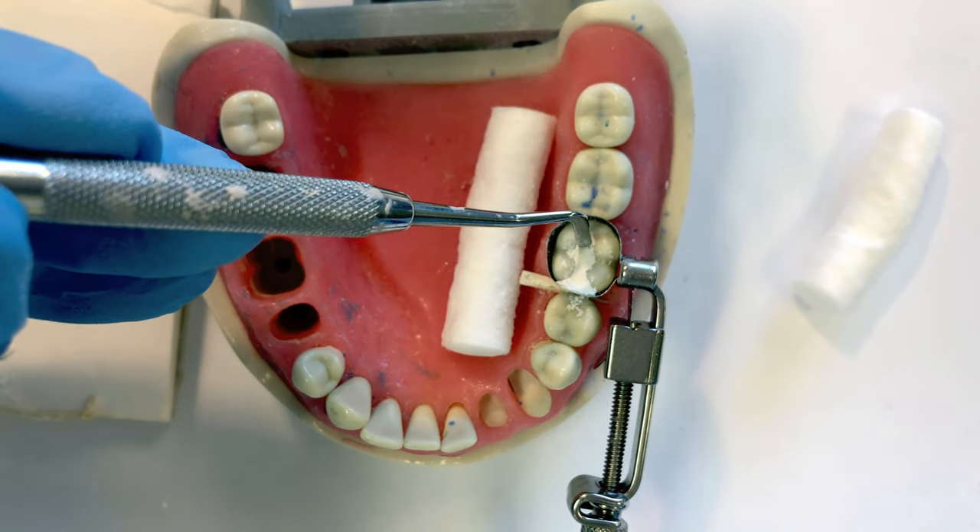Carve some anatomy back into your filling material before it sets. There is always opportunity to fix it once it hardens, but it's easier to do while it's still in this malleable, flexible state. Other reasons to use IRM: after a root canal procedure you need to close that access point opening, and they'll do that with IRM or some other intermediate material like Cavit or Fermit.